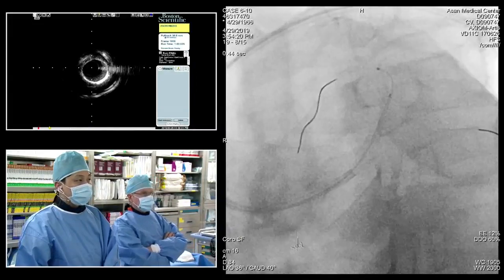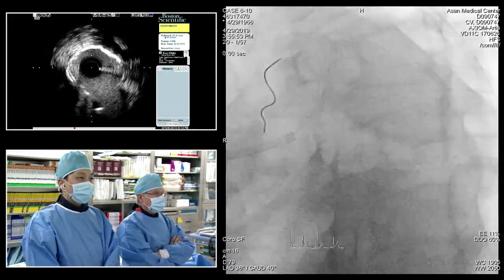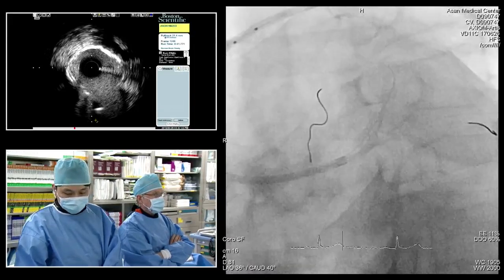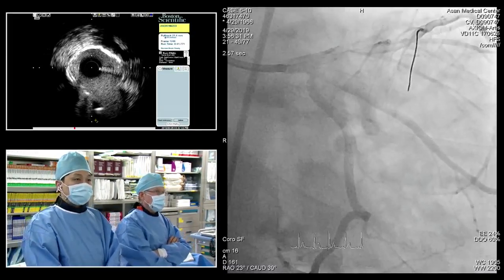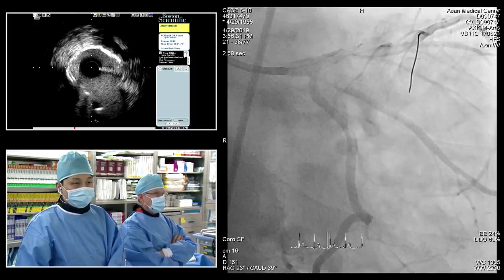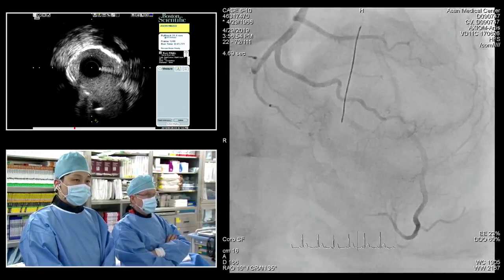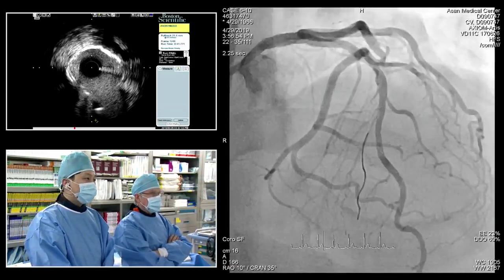We took traditional three pictures because you can always have surprises, you never know. So we went to the caudal area. Okay. Here it looks fine. And always look distally because the wires sometimes go outside the coronaries. Okay, and this is the cranial. It's fine. The wire is in the septal, but it's okay. Great. You saved the money.